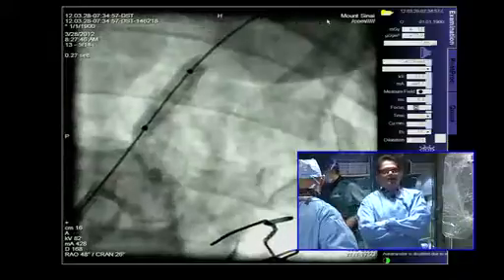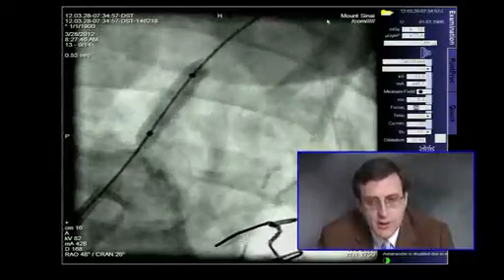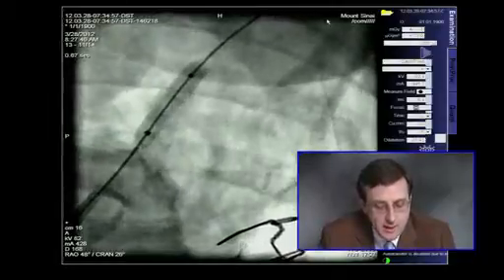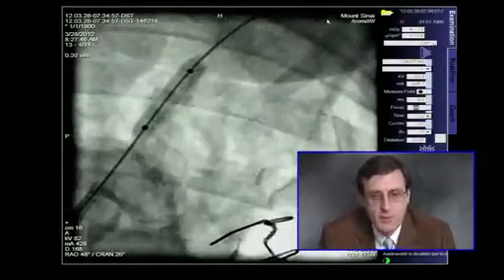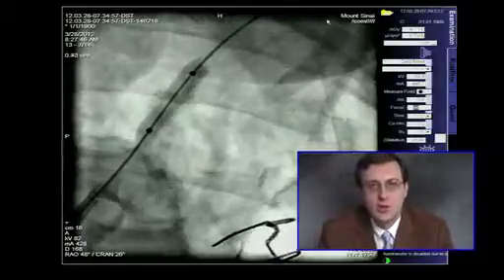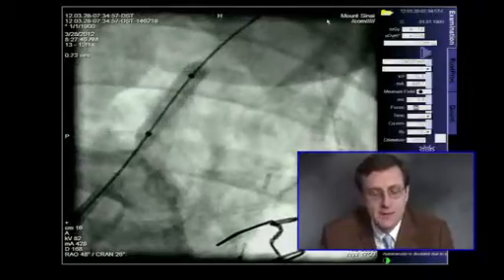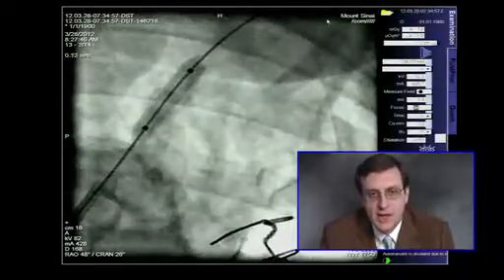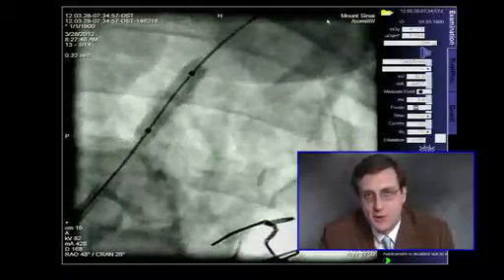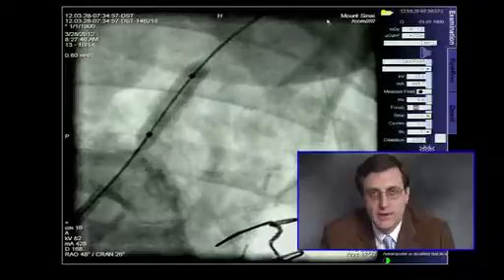Now we have a question from the audience, PK, and probably it's based on a previous picture showing some vertebral pinch. There was a question: are we concerned about the vertebral stenosis? I think subsequently this has resolved, but I want to ask you the second question that is here. Are we concerned about embolization of materials in the vertebral, and when might that be more pertinent than other such cases?